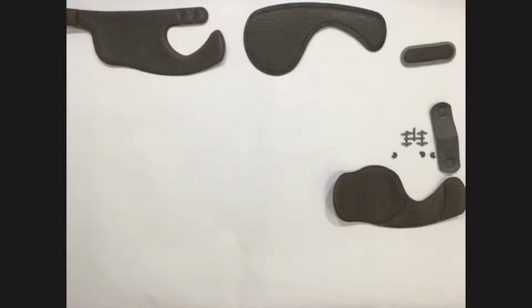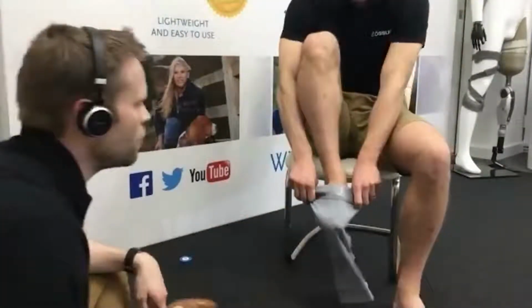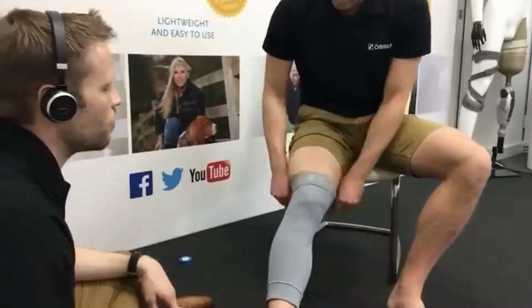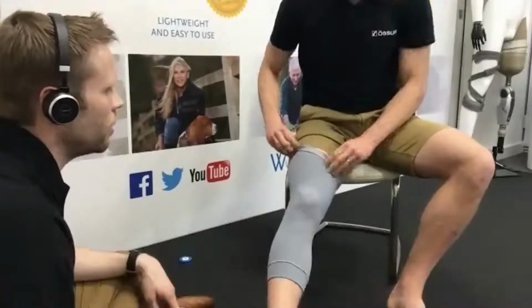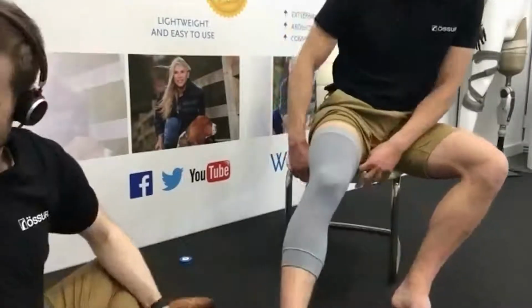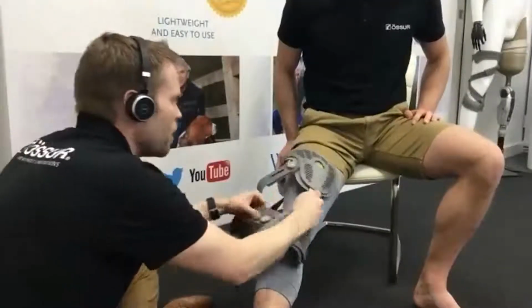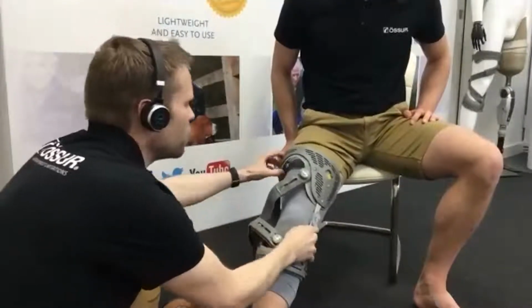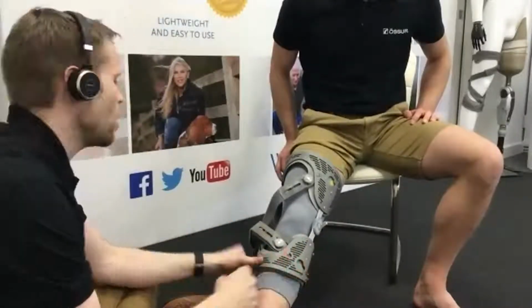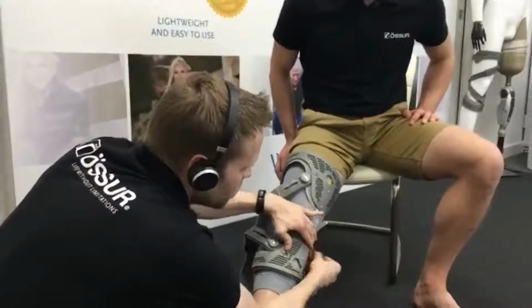So I'm going to give this sleeve to Pete. He's going to place it over his leg, and you can see he folded the silicone over before he actually brings it up nice and high, folds the silicone over at the top, and that helps to maintain suspension. And when we come to fit the brace, remember that whenever you're using the sleeve, it's important to add an alternative method of suspension. So in this case, we're using the gastroc strap, bringing that one into position and clicking it there.